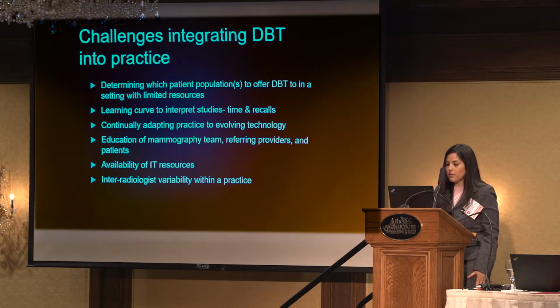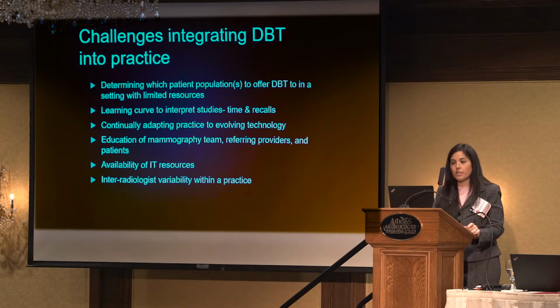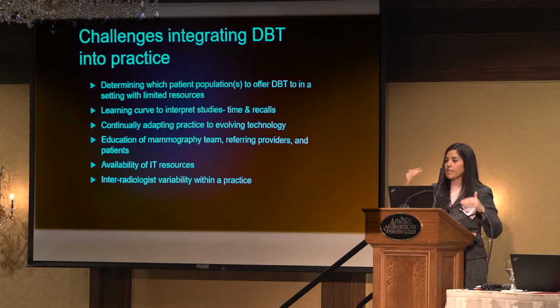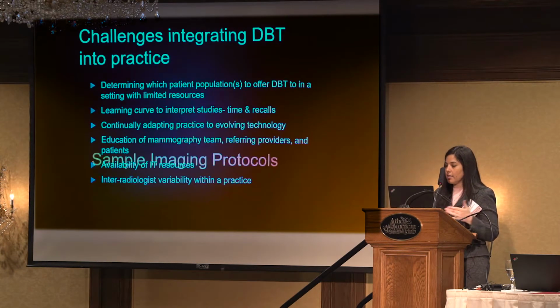And also dealing with inter-radiologist variability within a practice. What one radiologist sees on a screening mammogram and says, this is a tomo finding, I would go right to ultrasound. Well, when the diagnostic radiologist is a different radiologist who says, I'm not convinced, I guess I would like additional diagnostic views, then how do you schedule that patient? Do they have their ultrasound first? Do they have the diagnostic first? How does that work with your patient schedule? So coming up with some protocols that are a little bit standardized can really help mitigate that.